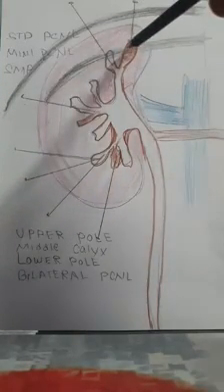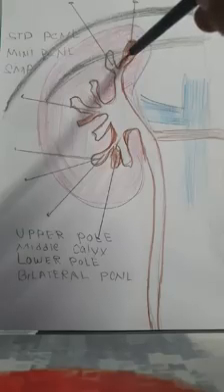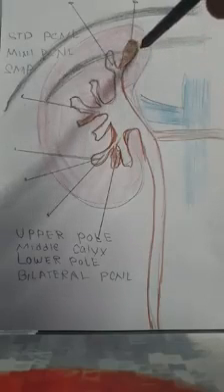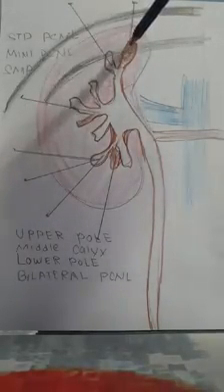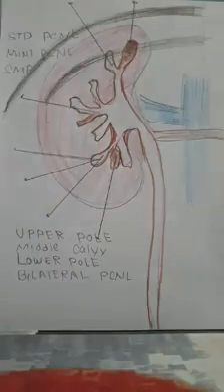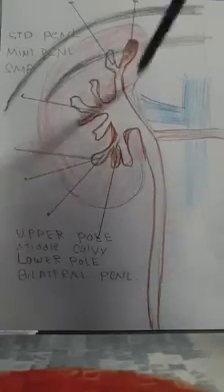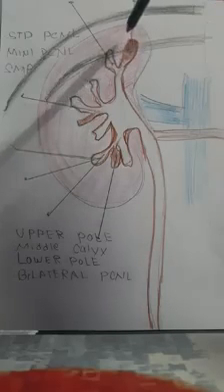In cases where there is always a rib in front of you, I don't want to go below, I want to puncture from above as much as possible, above the ribs. Below the ribs there are lots of blood vessels and there is a chance of injury when you are dilating. So I try to puncture above the rib in the posterior superior calyx. It's always a bullseye technique, very precise and very easy to learn. So what I do is I make a 0 degree fluoro, and I put my point with the needle.